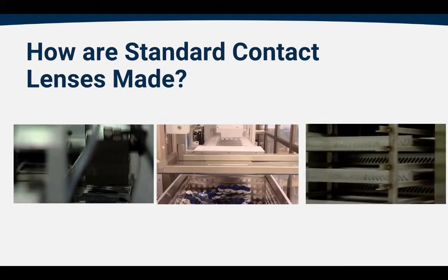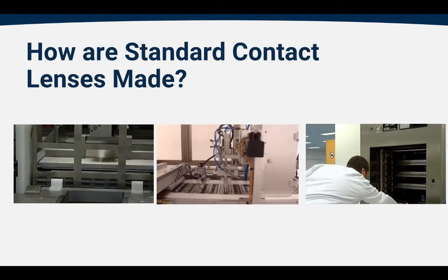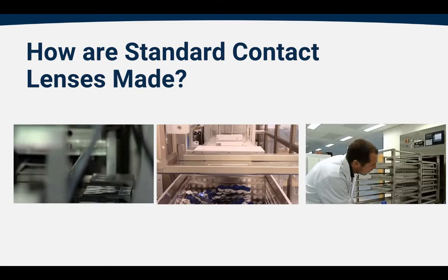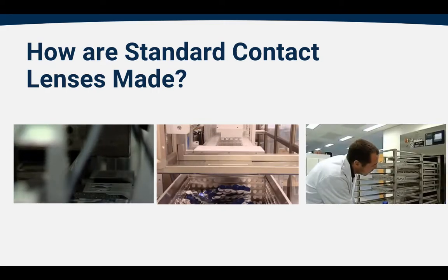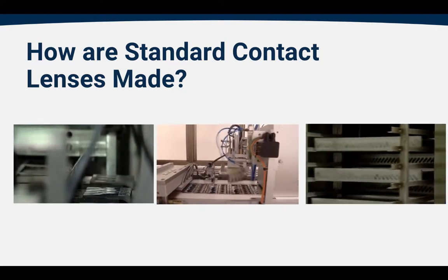The new sponge is a rigid, dry form of a sponge, and once it undergoes that hydration process, it then becomes soft and pliable. Soft contact lenses in this standard contact lens category are very much the same. They become soft and pliable as they become hydrated.